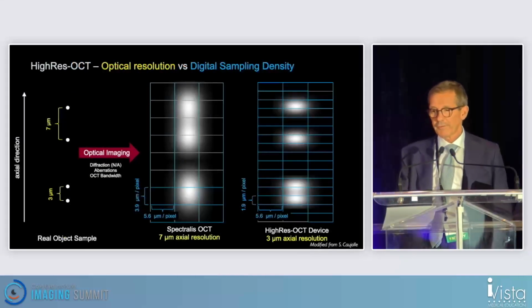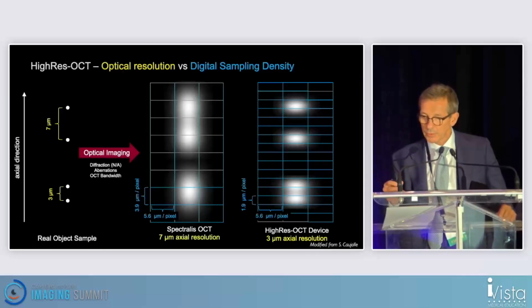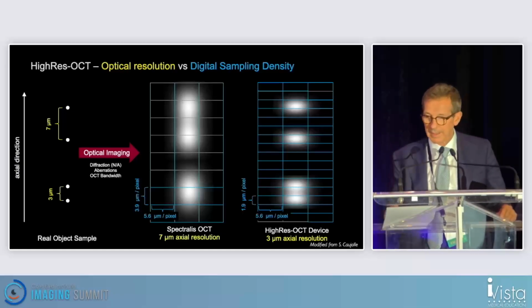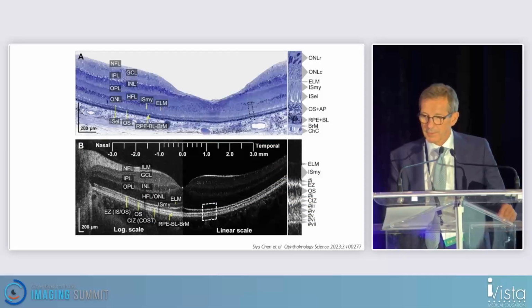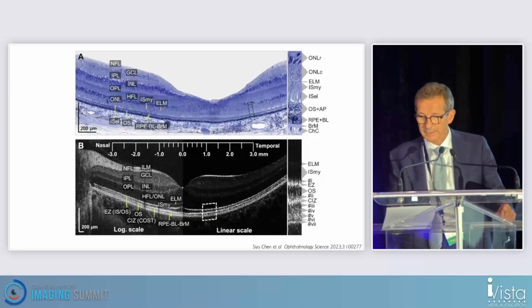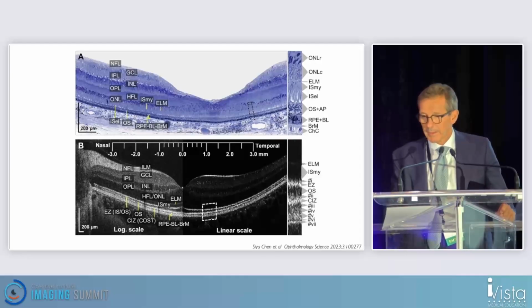Of course, if you increase the resolution, you can see much better the difference between the lines. These are images from Professor Fujimoto's group, and you see that the resolution is quite impressive compared with the histology.